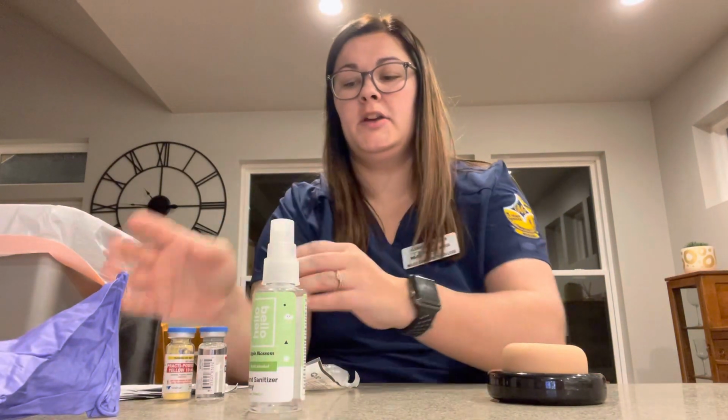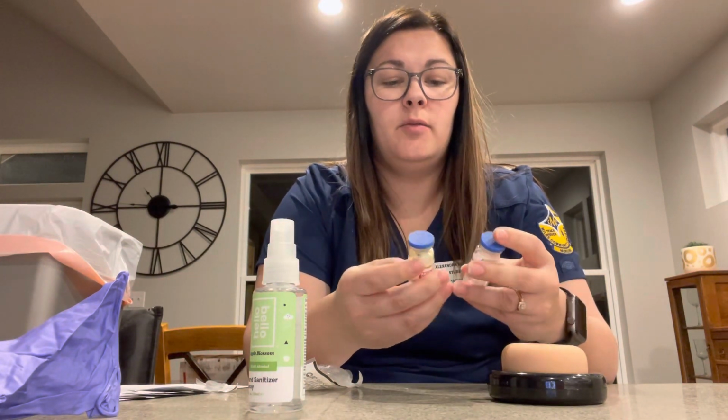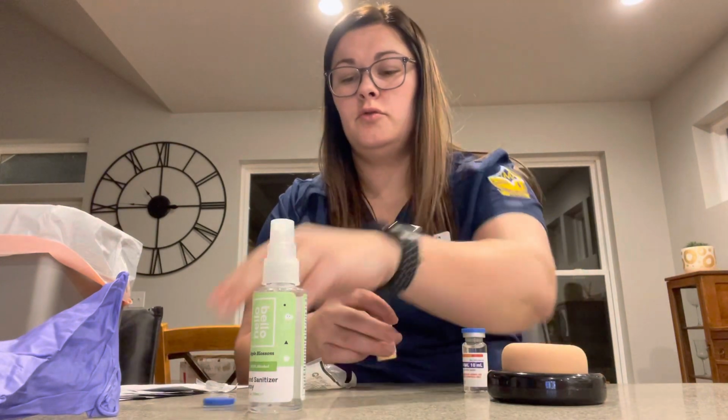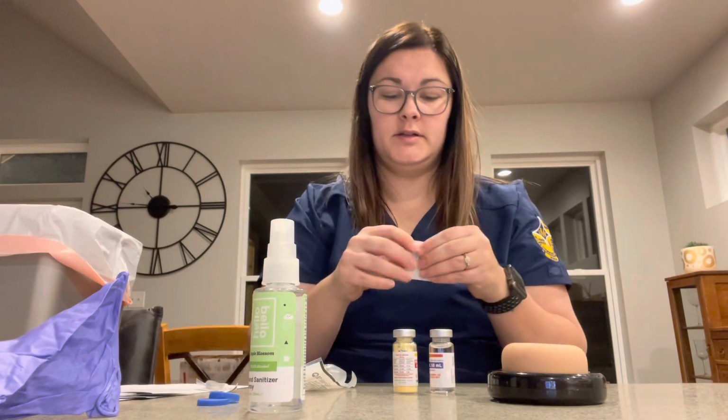I will perform hand hygiene. I will then check both vials, make sure there's no cracks, no precipitation. I will verify the expiration dates. And then I will remove and cleanse both vials.